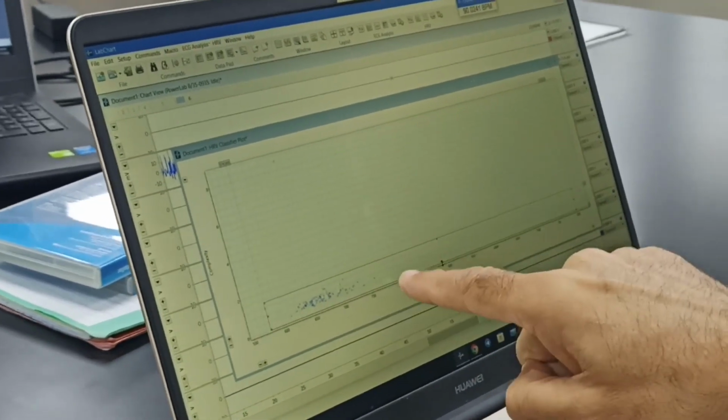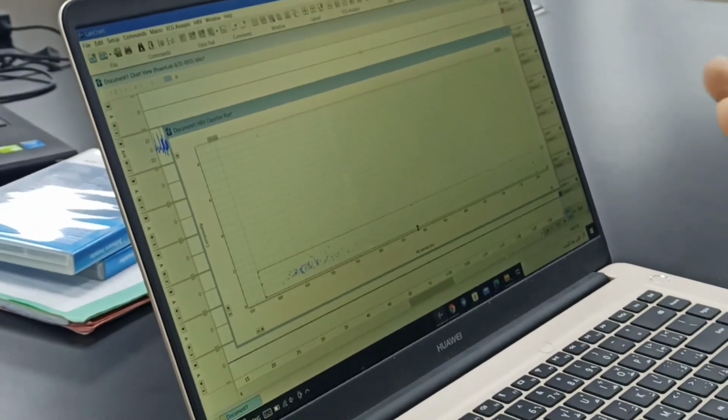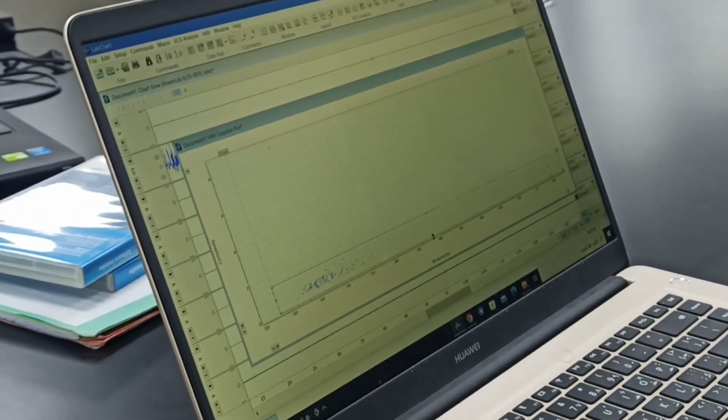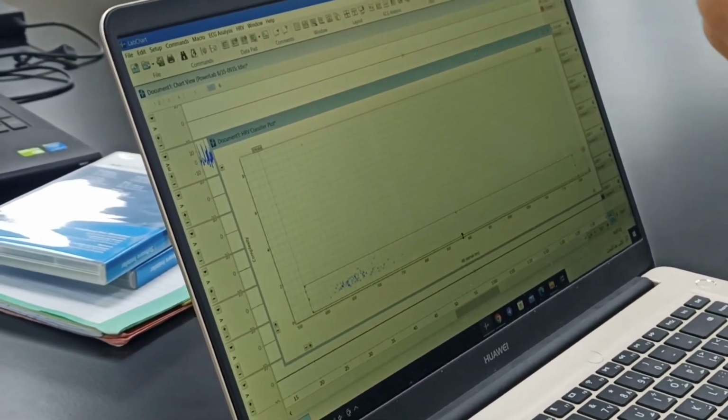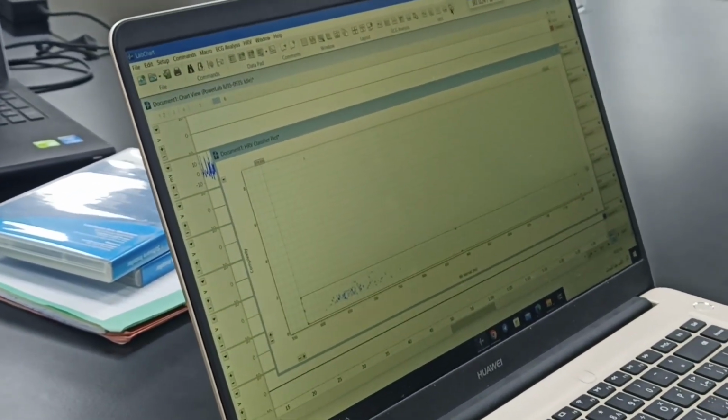Now their color has changed. All of them are blue. Blue here means all beats we have okayed. They are correct. It will be blue only if this whole square or rectangle, I should say rectangle, is encompassing all these beats. Now we will give a command.